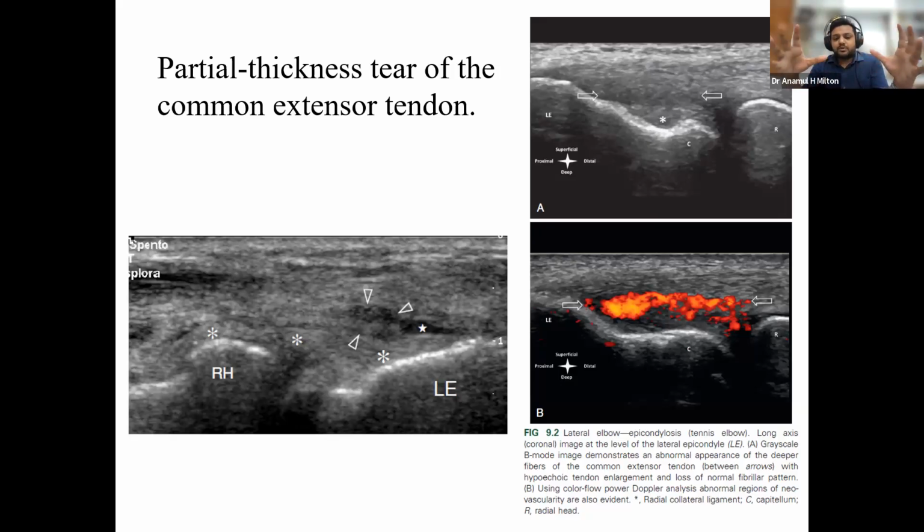If it is not pathological, that is fine, but if it is, you have to ensure whether it is pathological or anisotropy. So the heel-toe maneuver and toggling is very important for ultrasound.